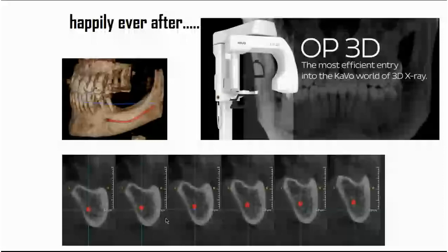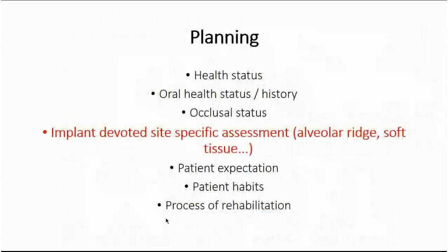When I started as an operator in the field of implantology, it was much more comfortable and accurate to use these clear and really potent radiological images and constructions, which gave me confidence that I can act in almost all situations, whether it is initial implant treatment, a bone augmentation, or any other kind of issue we should solve.